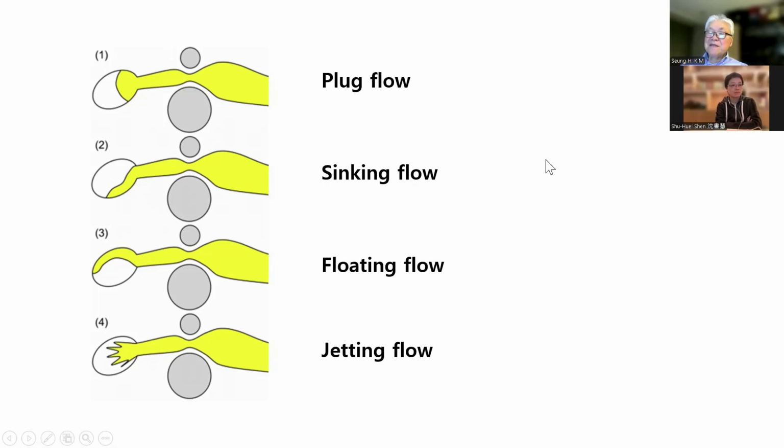But still, I think for a doctor who is not very much interested in Nutcracker syndrome, it's not easy to focus on the left renal vein, even for a very short time. So now what we are doing is we collect a lot of these CT cases and train the machine, and we may make an AI program for categorizing these contrast patterns in CT.